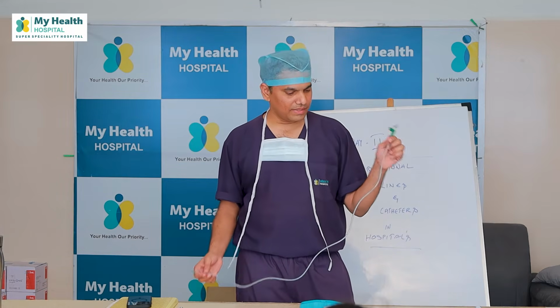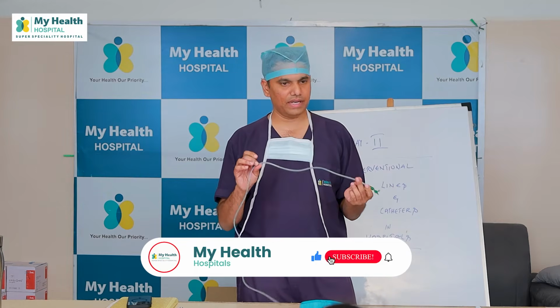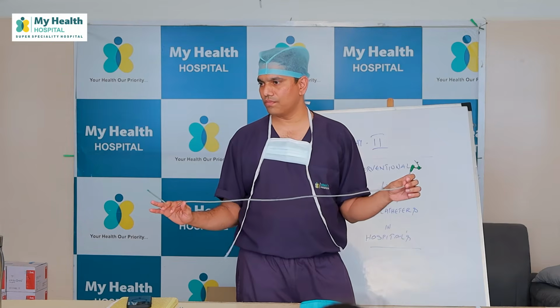Very good. 16 का कौन सा कलर है? Very good. 18 का ठीक है. चलो, so this color holds true for every, what do you call this, PVC lines. Okay, for all lines this holds true.